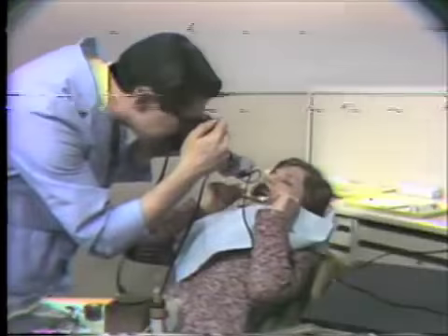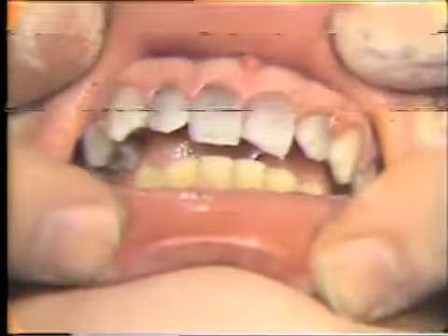And we'll just slide those right under the gums again. And will you hold on there, please, for me, Carolyn? That's fine. And close up just a little bit. That's fine. One and two. Now we get a real good look at this young lady's teeth. Again, we can see there is some change between the upper and lower teeth. The upper ones look a little bit lighter.